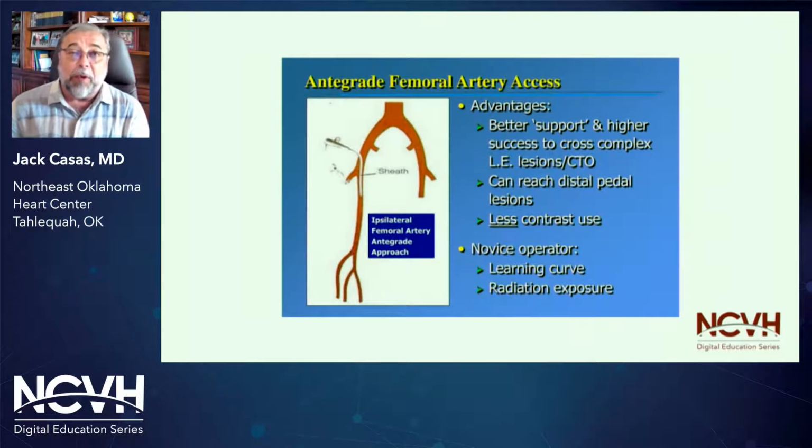So we've broached this a little bit already. The advantages are better support, and there's a higher success to be able to cross a CTO below the knee. You can reach distal pedal lesions. Again, I stress there's less contrast use. However, for the novice operator, the learning curve of getting access is high, and because we tend to use more fluoroscopy time when we're not sure what we're doing, the radiation exposure initially is going to be higher.